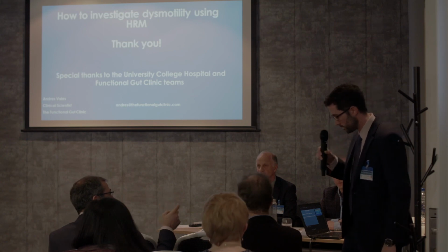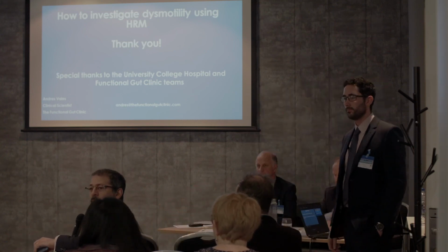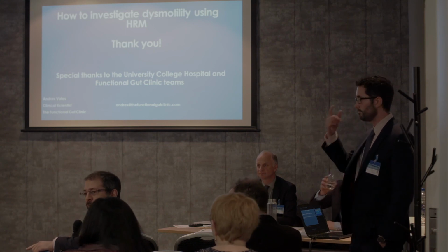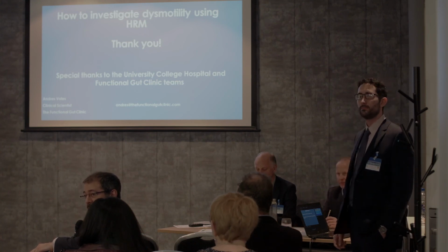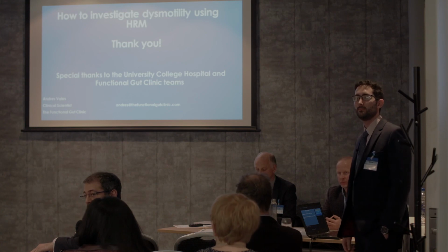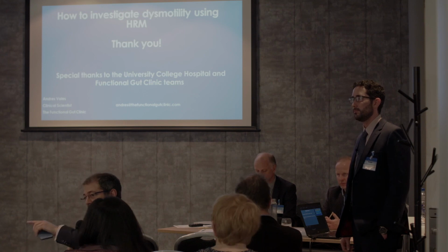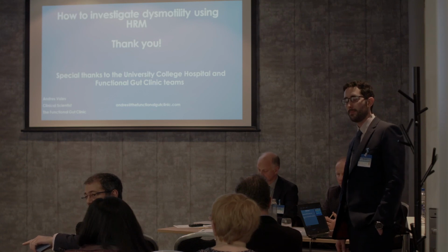I think Rami had an additional point. Sorry, there's one more point to make. So who asked that question? Hi. The standard is 3 centimeters beyond the distal marker. However, there is possibly pressure zones within that. So we have to make sure it's within a low pressure zone, because ultimately the IRP, which is the esophageal gastric pressure gradient, will depend on the gastric pressure. And so we want to identify the right place.